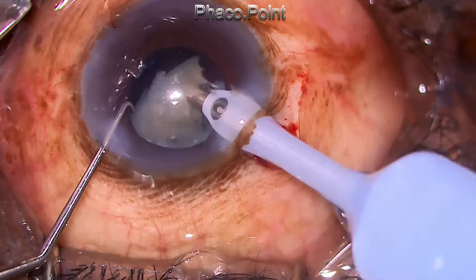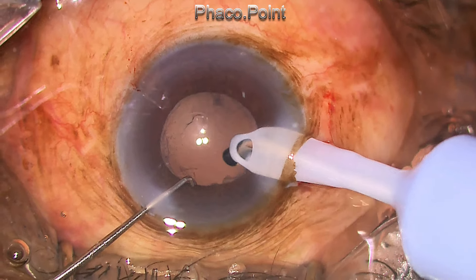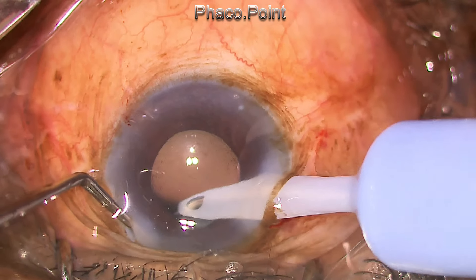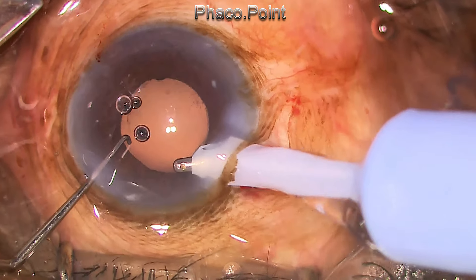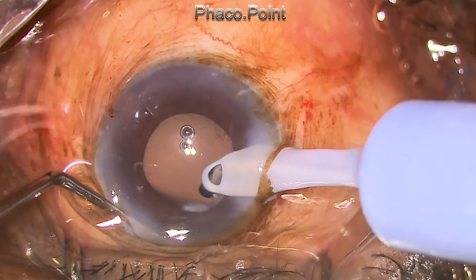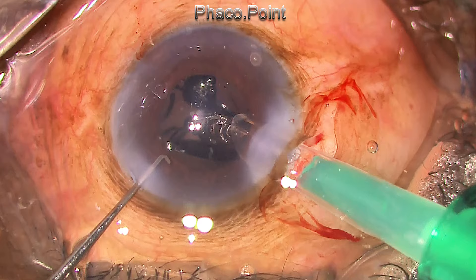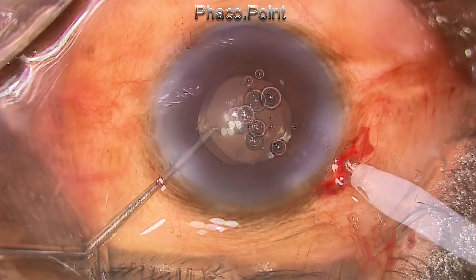The cortex in this case had formed a sort of inspissated girdle that was stuck within the capsular bag, close to the equator. When attempting removal with irrigation and aspiration at a vacuum of close to 500 mmHg, a good purchase could not be obtained — the fluffy cloud-like cortex was simply breaking off and coming into the aspiration port, while the thick inspissated girdle remained firmly plastered onto the equator between the anterior and posterior capsule. The decision was made to introduce the intraocular lens first to avoid a posterior capsular rent while working in the periphery.